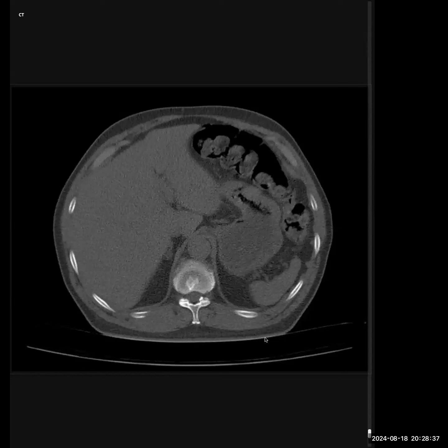Thank you. And let go of the mouse, please. Yeah, you can let go of the mouse. Yeah. Okay, so this is your second case.